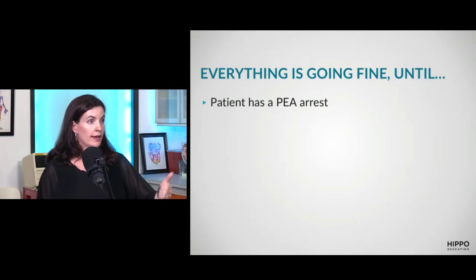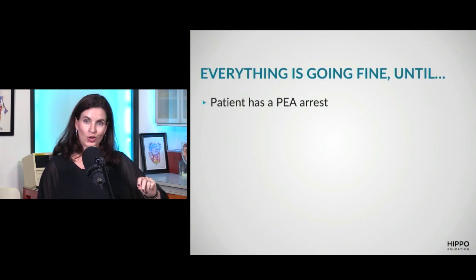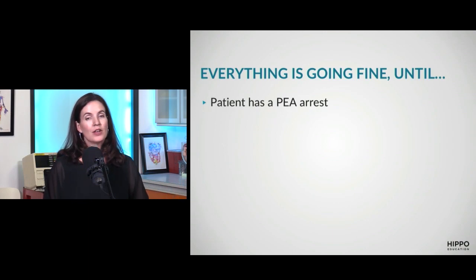And so in general for these people, I am starting ACLS. I'm checking where the tube is. For any patient who has a cardiac arrest, I will take them off the ventilator. The ventilator is just too difficult for us to manage in terms of our cognitive load during a cardiac arrest. So just manually bag to make it easier for yourself and turn off the vent so it can't alarm all throughout your arrest. And then you want to think through your differential diagnosis for these patients.